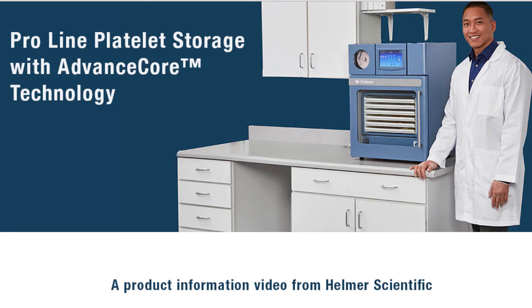Here at Helmer Scientific, we're thrilled to show you our ProLine platelet storage systems powered by advanced core thermoelectric heating and cooling technology.